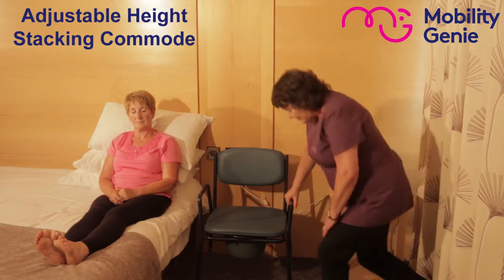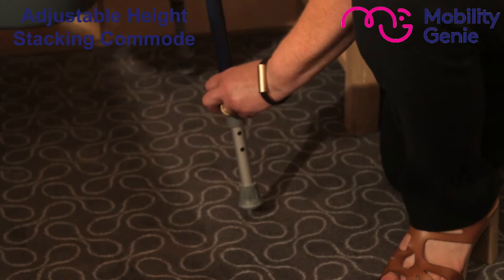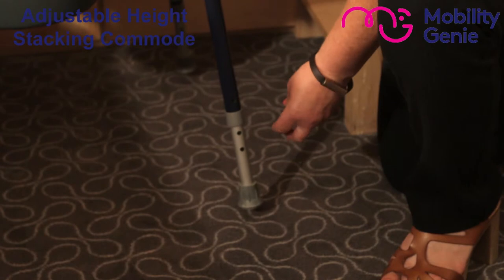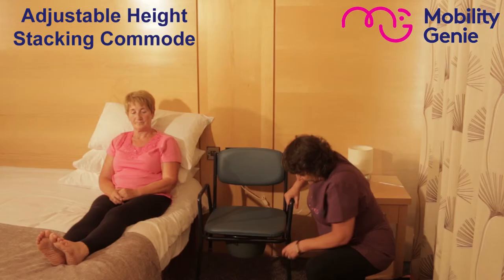To adjust the commode, you'll notice there's a clip on each leg. You just remove the clip and move the inner tube up or down depending on the height of the person. I have it set for Margaret at this height.